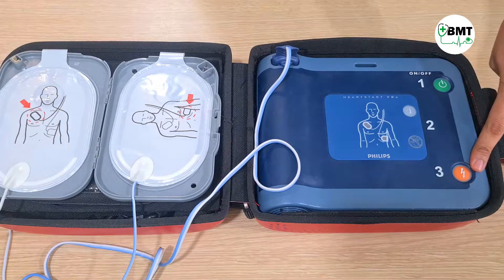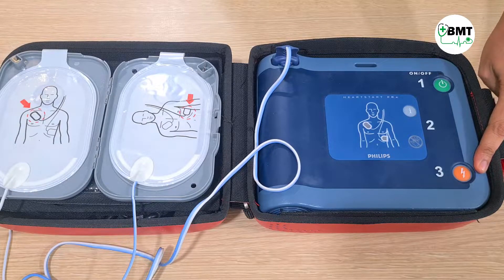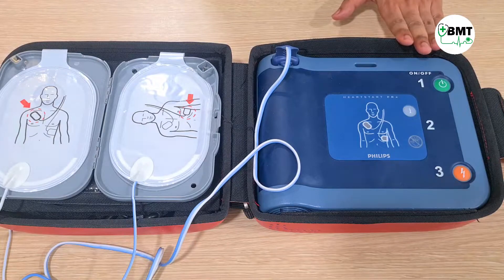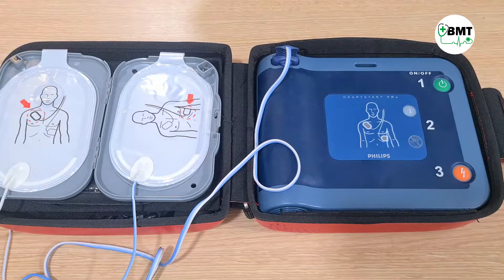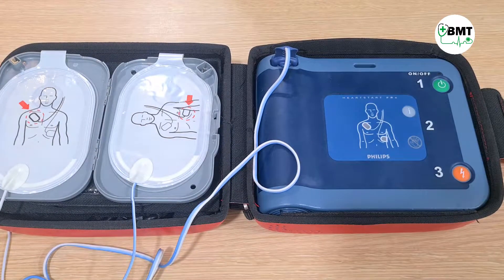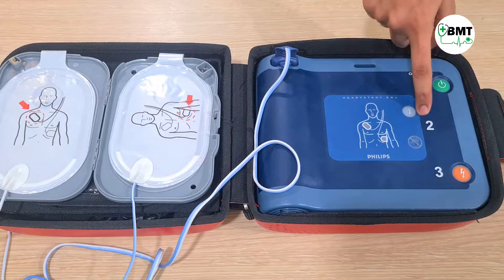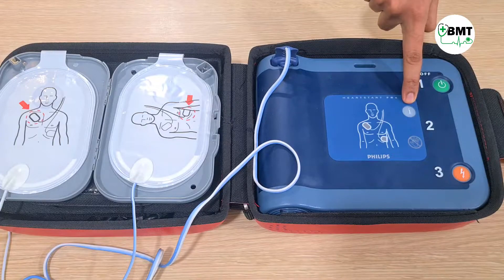After pressing the shock button, this will not require any separate ECG analyzer. It will automatically detect the patient's ECG and deliver the shock to the patient. After the shock has been delivered, for CPR help, press the info (eye) button. This will guide you through all the steps involved in the CPR function.